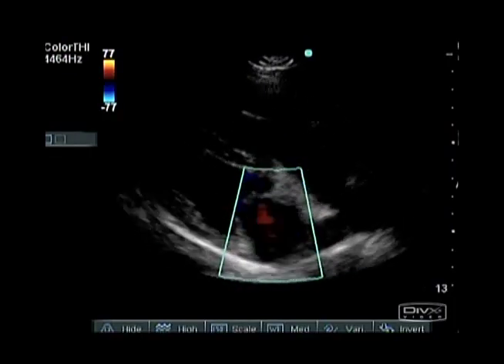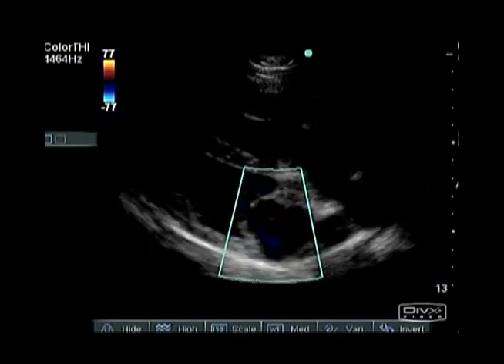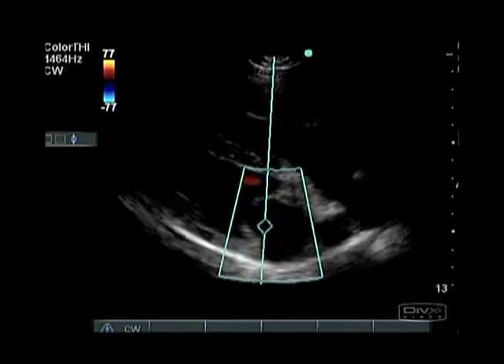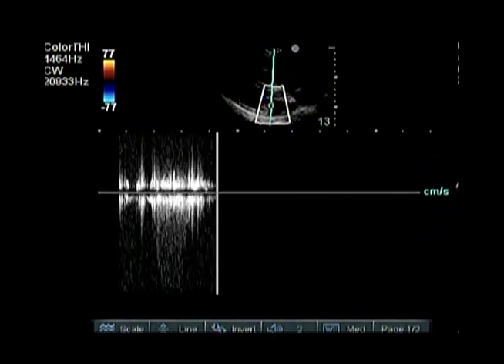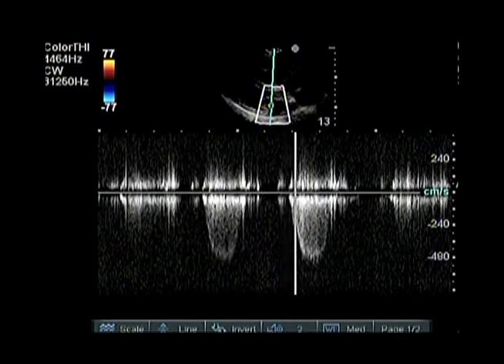Systolic leaks of the mitral or tricuspid valves result in a second exit for outflow of blood from the pumping chamber. Forward flow of blood volume to the aorta or pulmonary artery decreases. Some blood volume leaks backwards into inappropriate chambers.